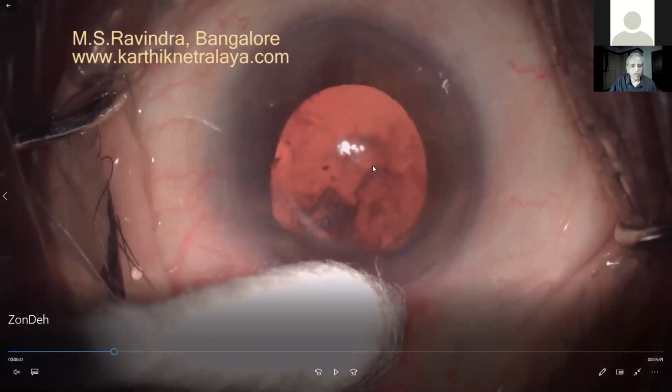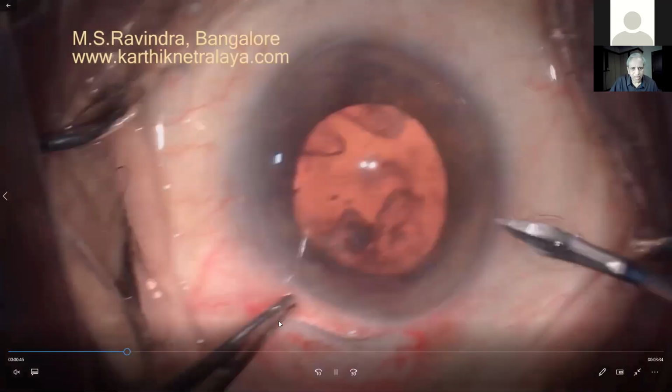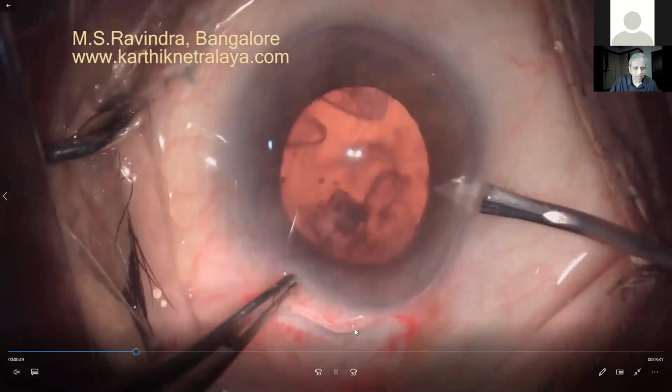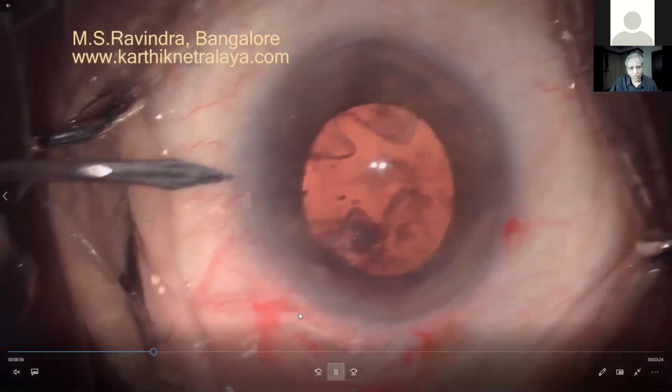The amount of fluid that goes inside is controlled. AC is kept not very deep. The deeper the AC I do, the chances of pushing these into the vitreous cavity is very high. And when I've asked for the vitrectomy probe, in the meantime, whatever vitreous that has come outside, I'm just removing it with the scissors, vitrectomy, whatever you call it. And the vitreous that has come outside, you can always trim it.